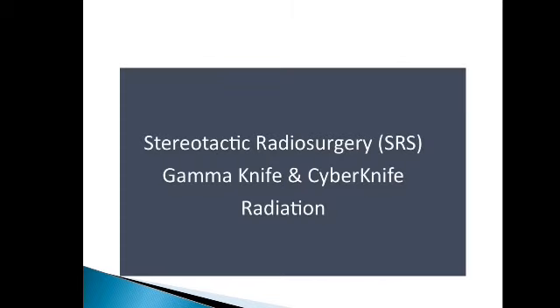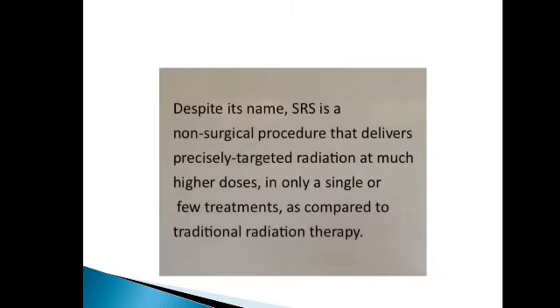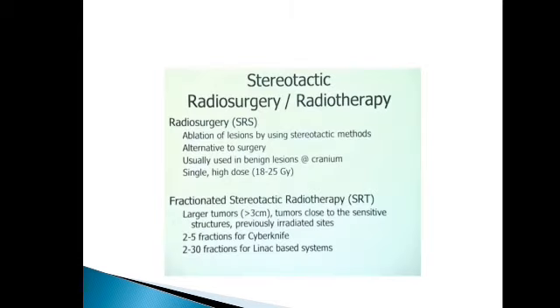And what is stereotactic radiosurgery, or SRS, gamma knife and cyber knife radiation? Despite its name, SRS, or stereotactic radiosurgery, is a non-surgical procedure that delivers precisely targeted radiation at much higher doses in only a single or few treatments as compared to traditional radiation therapy.